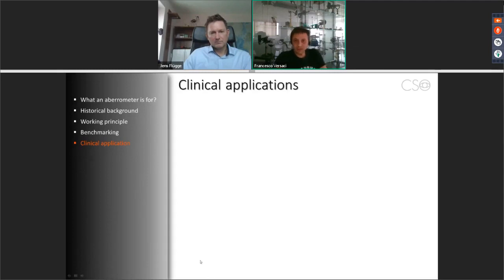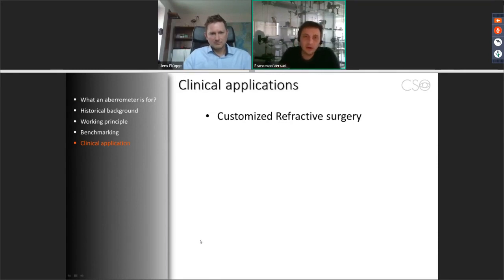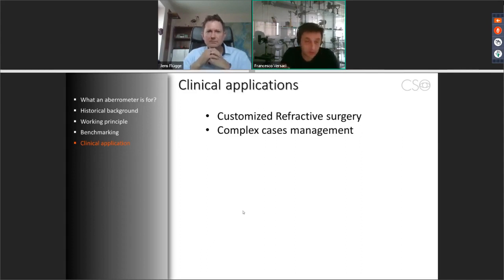Let's see some cases of clinical application of the device. First of all, and I think that is also the main reason for the device, is customized refractive surgery. But due to the very high resolution of the device, we can use it also to manage very complex cases, and we are going to see a couple of them.